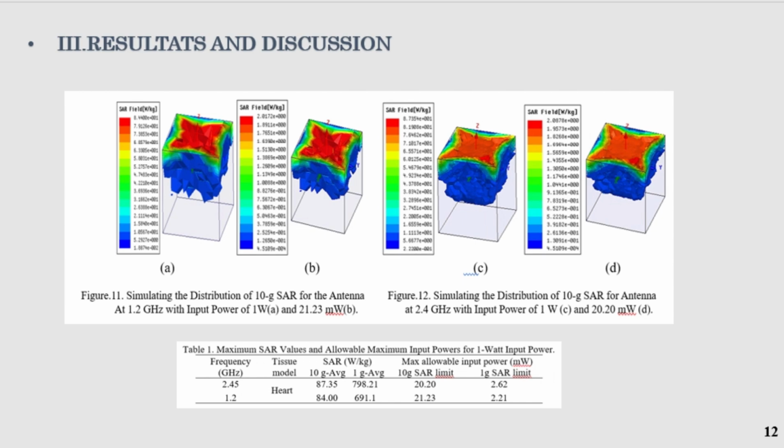Another important parameter to consider is the specific absorption rate. Assessing SAR is crucial to ensure compliance with IEEE biocompatible device safety standards.